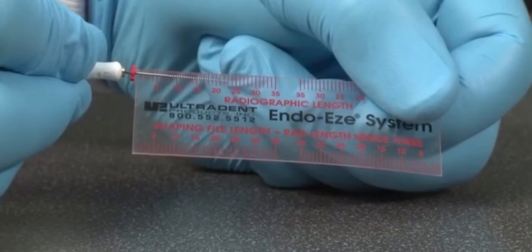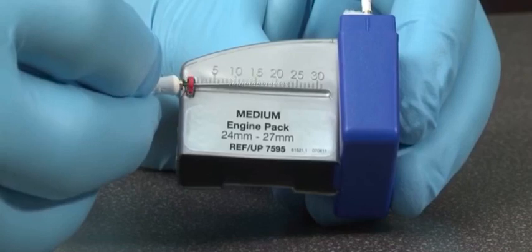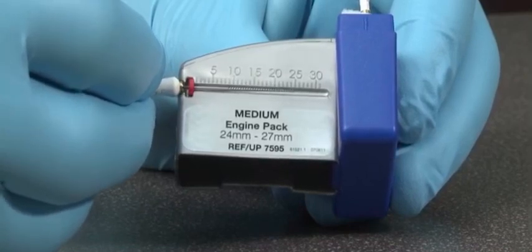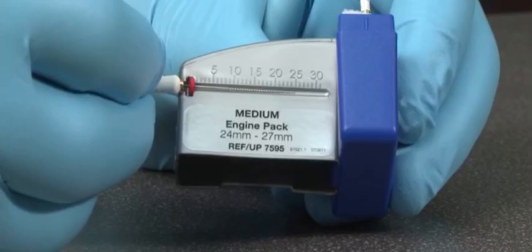Determine the working length using an endodontic ruler. To establish the working length, subtract 0.5 to 1 millimeter from the electronic length.